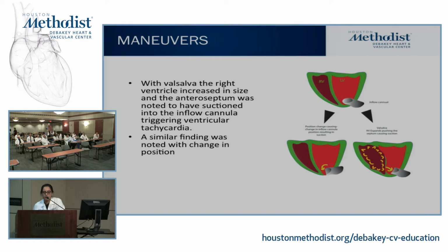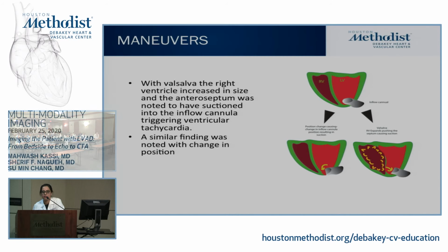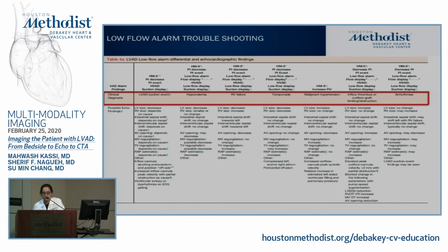I used to think of suction as just, okay, they have suction, they have dizziness. Now I think of suction and poor RV dynamics. So it has a lot of implications.